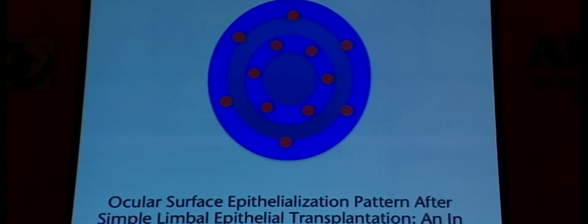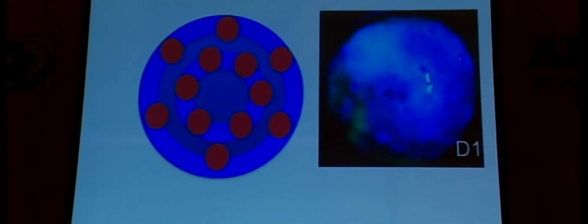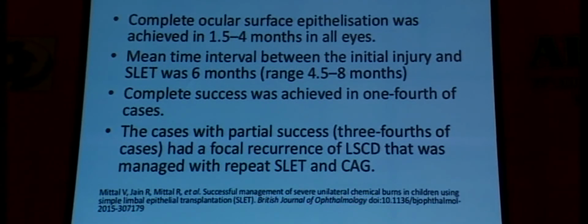These are the placements of the limbal biopsy pieces in 2 concentric rows on the affected cornea over the amniotic membrane graft. Each of these pieces then acts as a nidus, and the epithelial cells that are present then divide and re-epithelialize the surface all over the place. That is 360 degrees. If you see, each one of them has started producing epithelium, and now the entire area is being covered by the epithelial cells. So finally the entire cornea is covered.